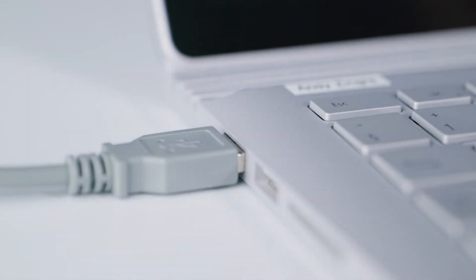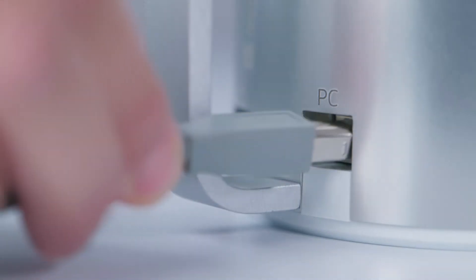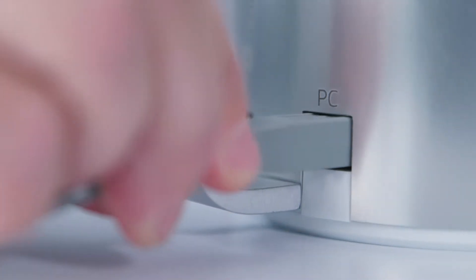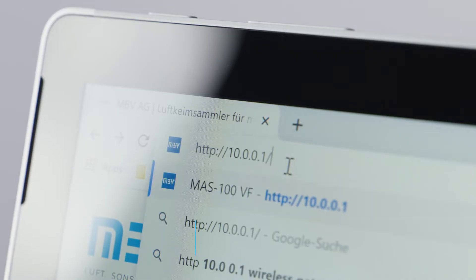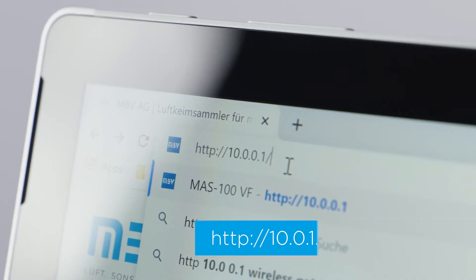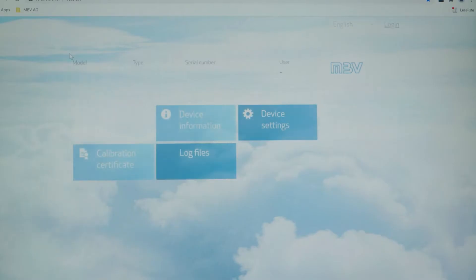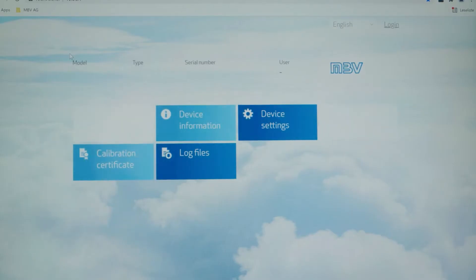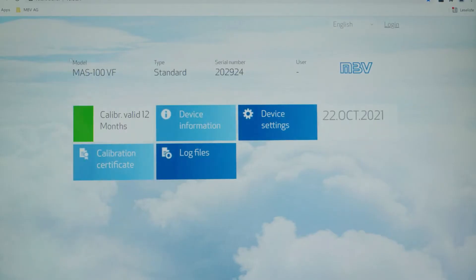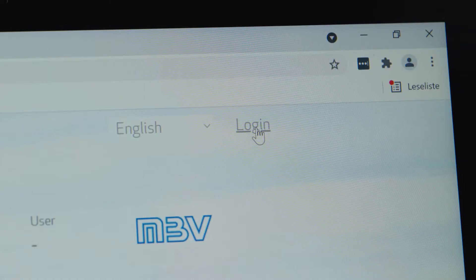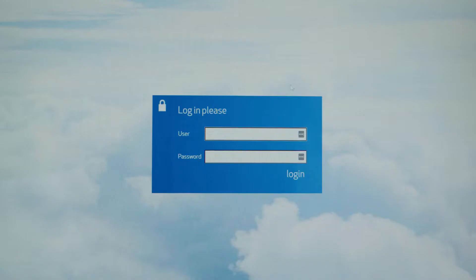Use the USB cable to connect the VF with a PC and start the browser. The correct IP address of the instrument can be found in the manual. You are now logged in as a standard user. For advanced functionalities you must authenticate with username and password. The login and authentication is described in the manual.